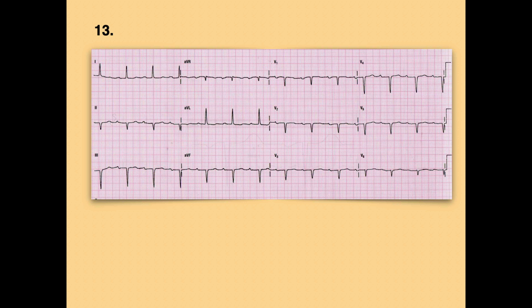Yeah, I think it's more than one box, right? It's more than one box, and also, when you have a situation where the entire QRS is made up of a Q wave, all it actually has to be is 25% of the QRS. In this case, it's 100% of the QRS. So you just look at it and go, oh yeah, it's pathologic. Okay, so yes, what about this one?